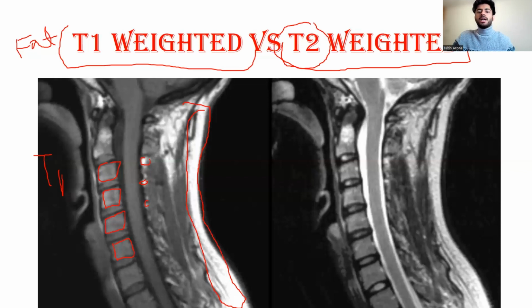So that means T2 weighted image will show you everything related to water plus fat. Why? Because the fat particles that were there earlier are still emitting energy, and now the water protons are also emitting energy. So now here you'll see that in T2 weighted image on the right side of your screen, the CSF is white, cerebrospinal fluid is white on both the sides, so that is water or fluid.